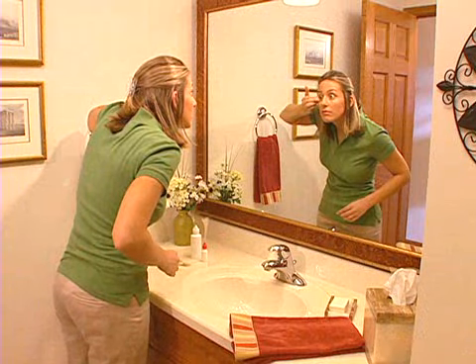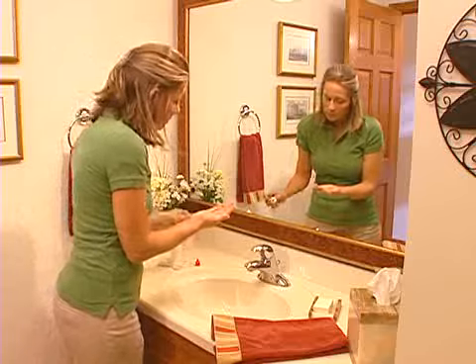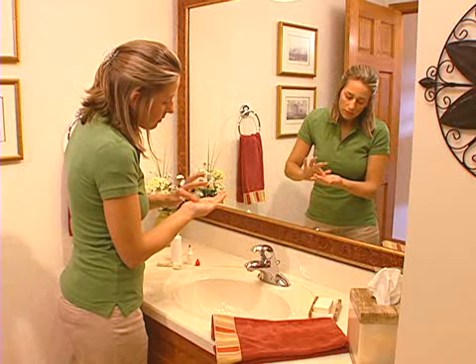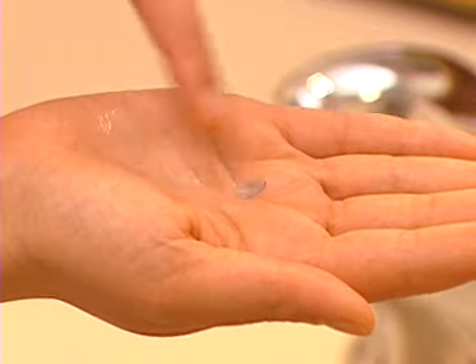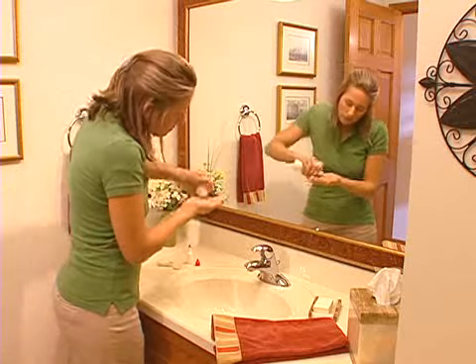Once your contact lenses are removed, they need to be cleaned to remove mucus, protein, and debris that build up on the lens surface during the day. Place the contact lens in the palm of your hand and apply a few drops of the cleaning solution recommended by your contact lens professional. Removing this build-up will not only make it easier for you to see clearly through your lenses, but will also make them more comfortable. Gently rub the lens in a back and forth motion, making sure not to rub the lens too hard. Rinse the cleaner off with an approved rinsing solution.